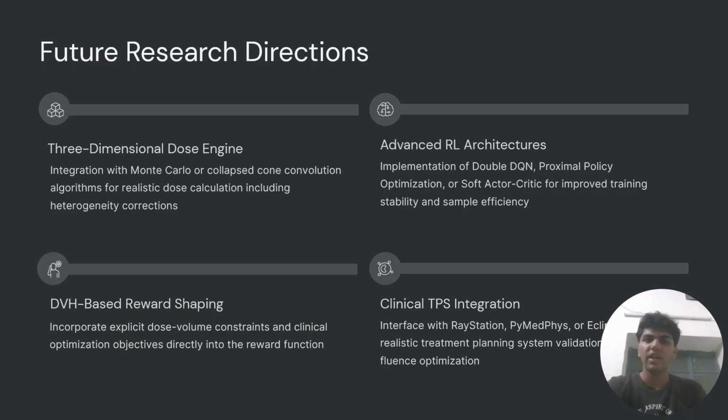We can try better RL algorithms. We have right now worked with DQN. There are many other advanced RL algorithms that may provide smoother learning and better performance. We can use a smarter reward function. Right now, we were using linear reward functions. We can start to use non-linear reward functions in our model so that it learns these relationships quickly and more accurately.